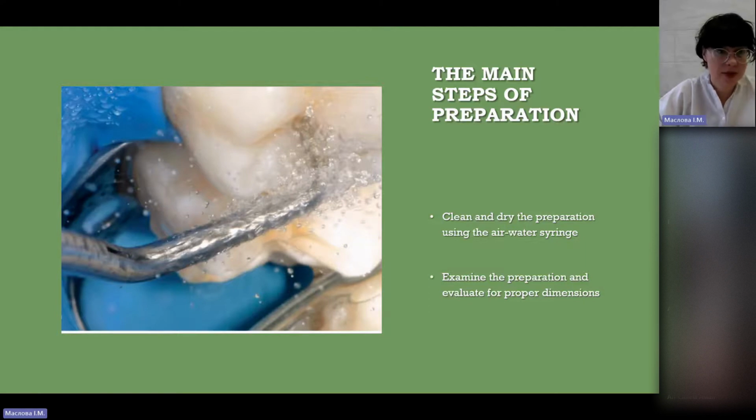We continue to discuss the main steps of preparation, and you can see the photo with the cleaning and drying of the preparation using the air-water syringe, and examine the preparation and evaluate the proper dimensions.